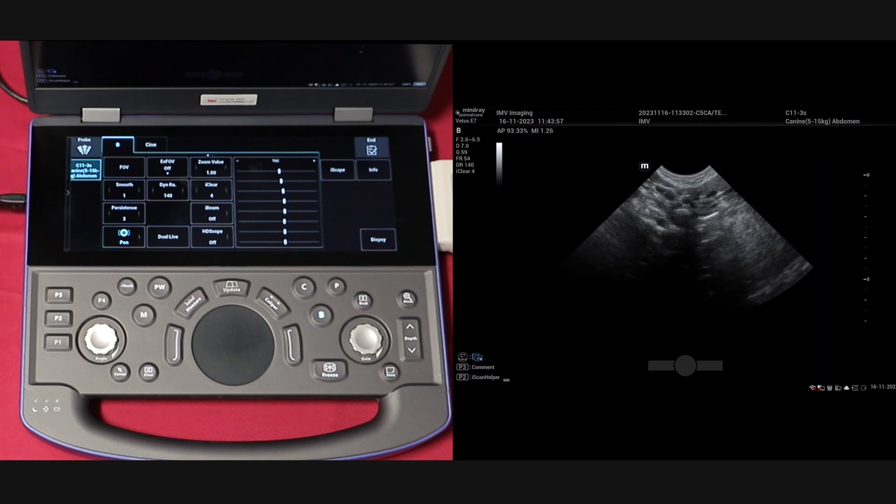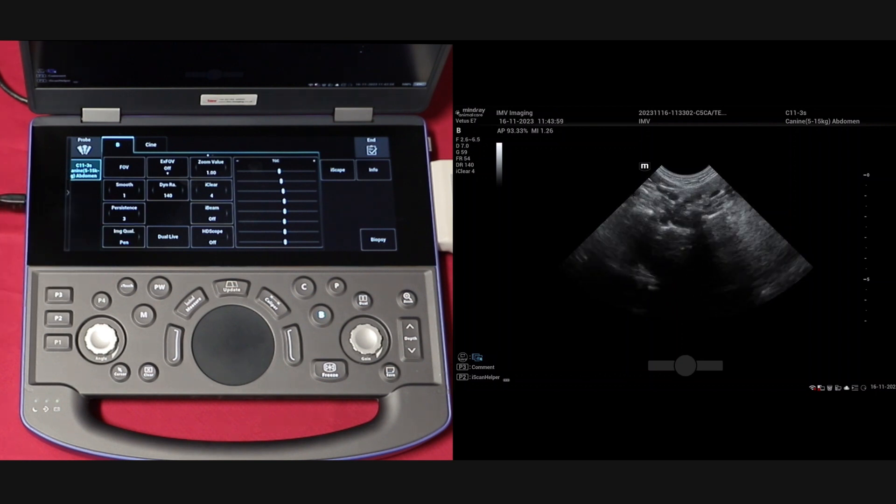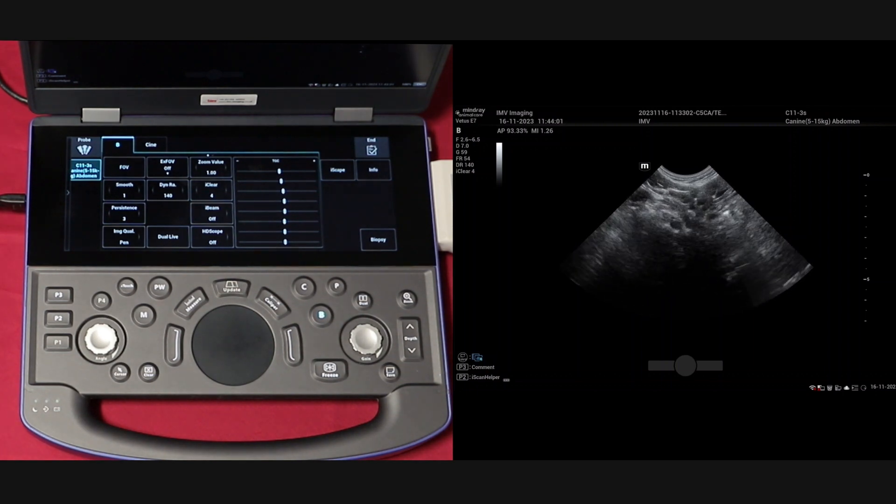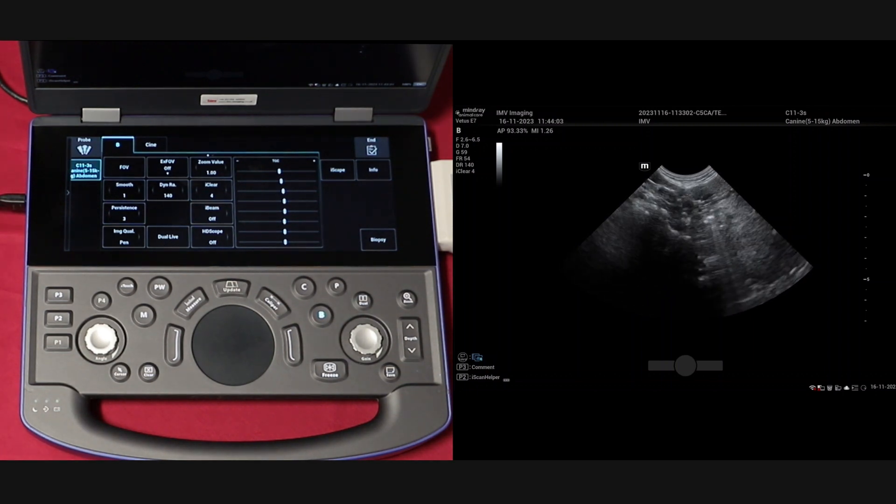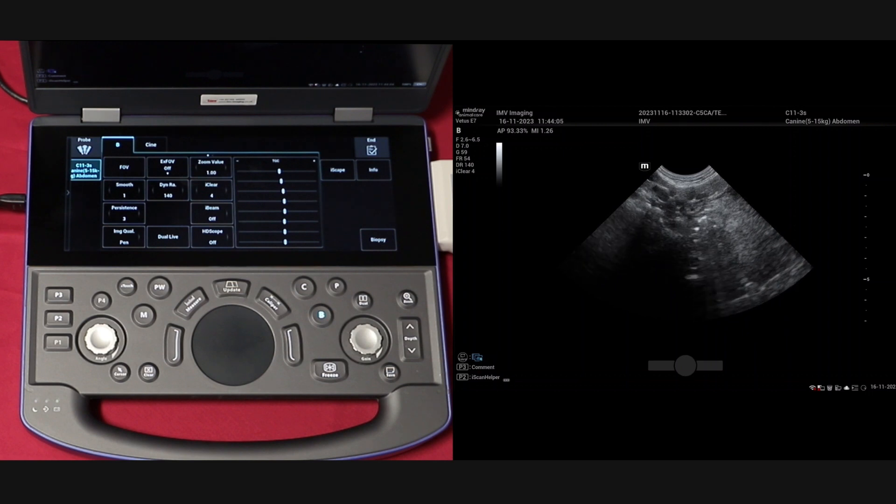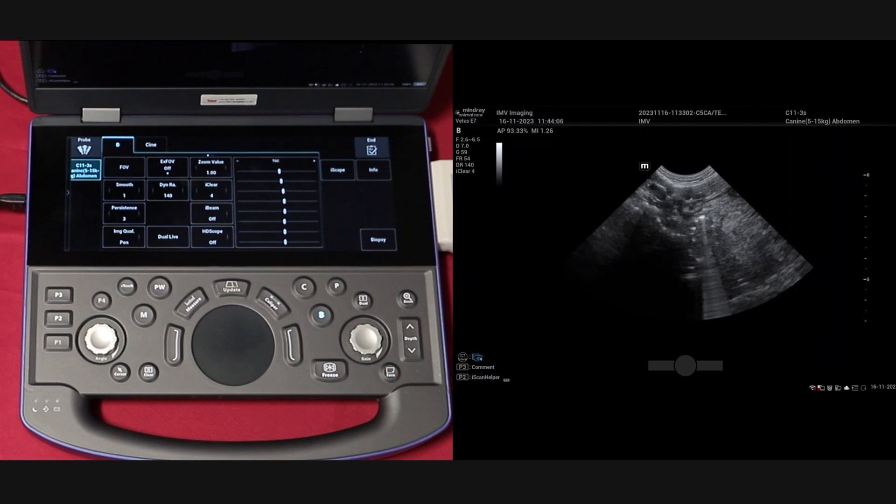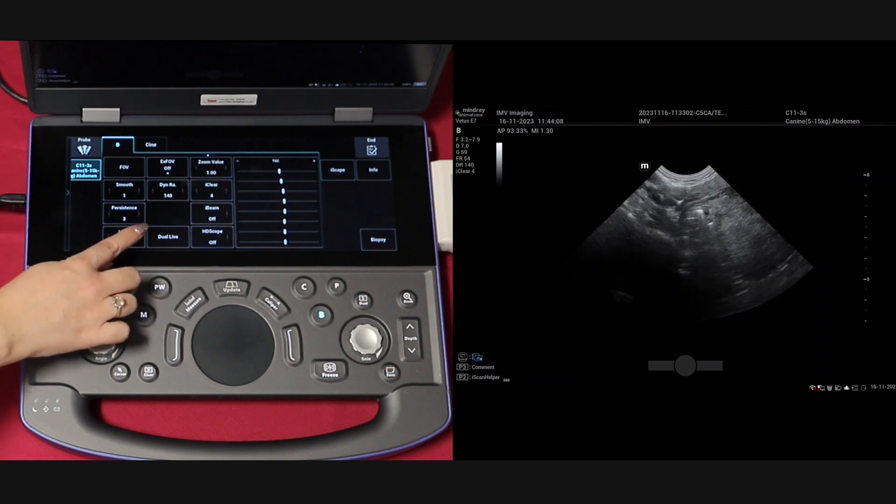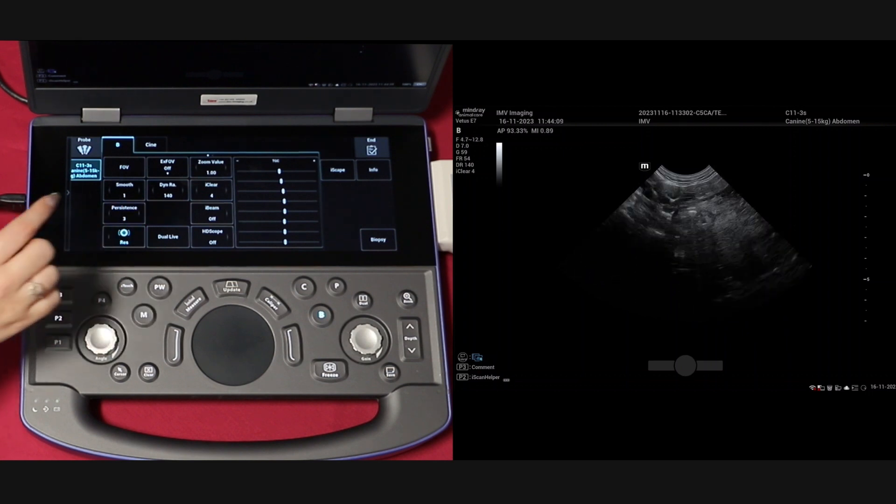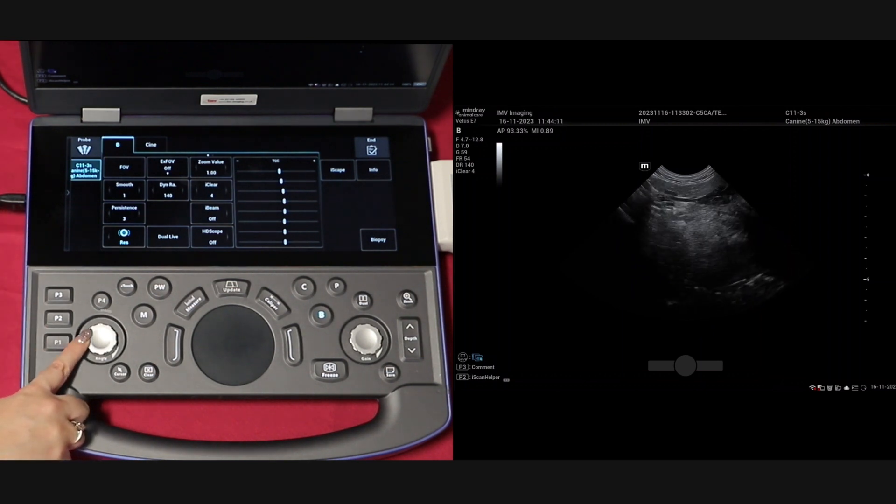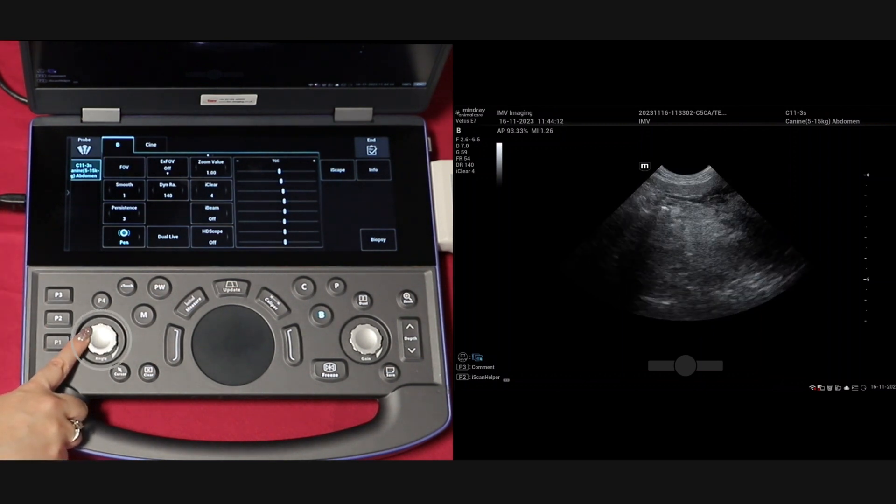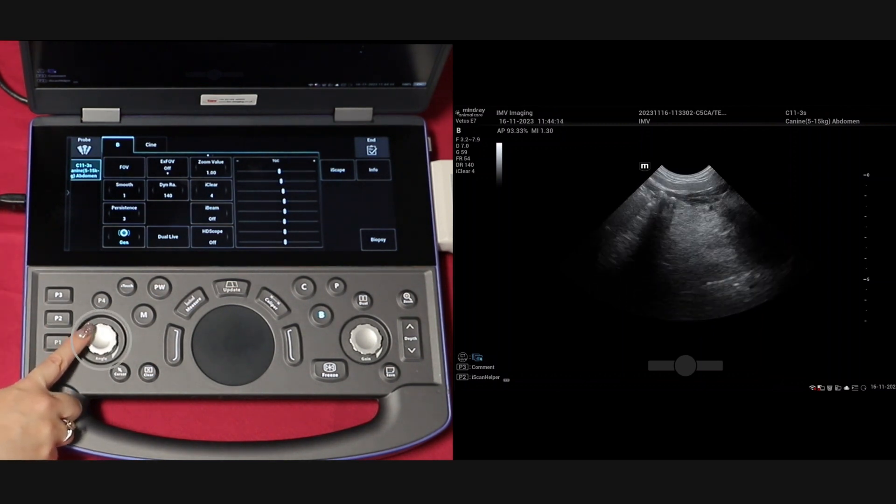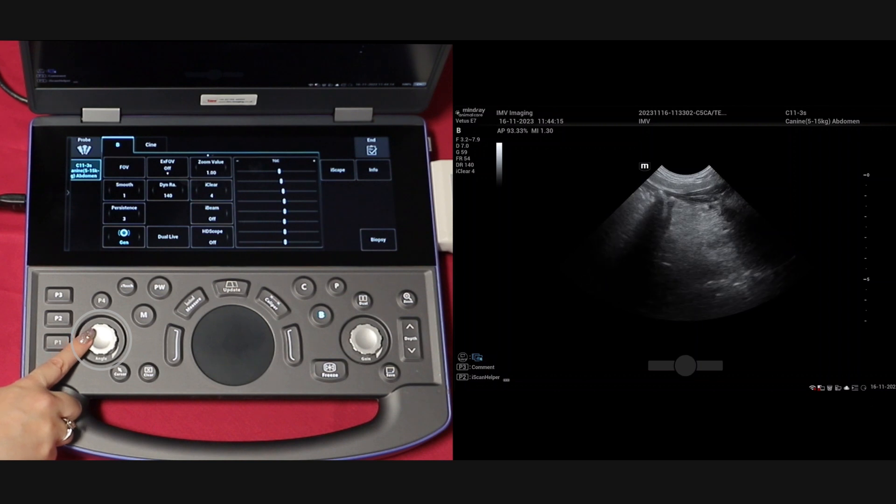Resolution is for more superficial structures, Penetration for deeper ones, and General for anything in the middle. You can control it by either pressing the arrows on either side of the button or by adjusting the angle dial located on your keyboard.